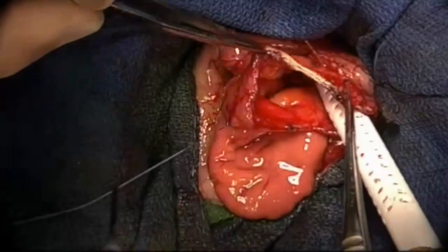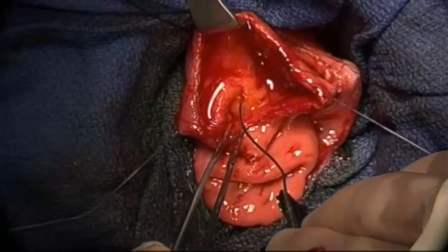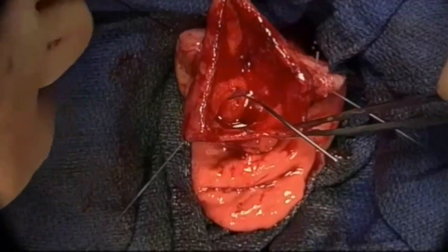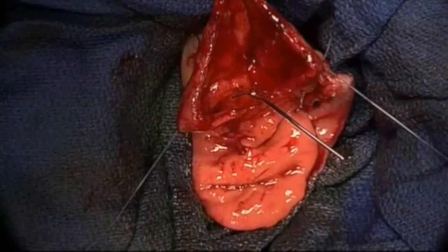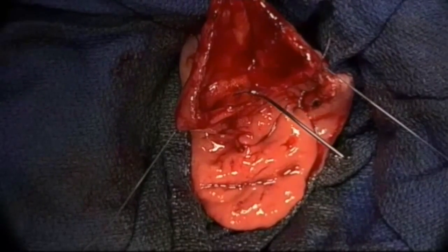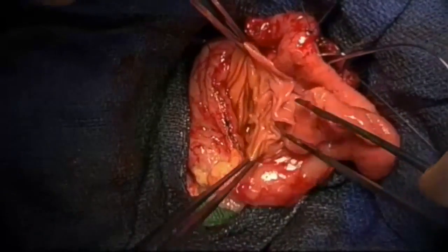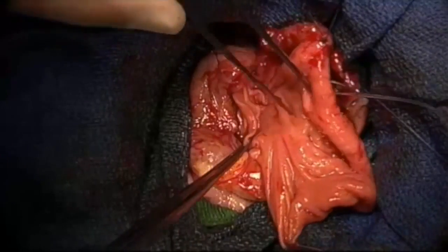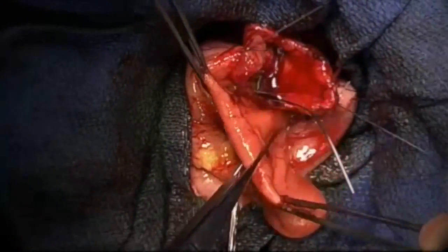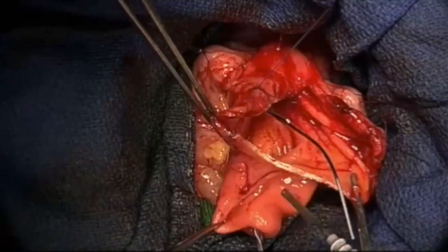Further dissection of the cyst revealed the major papilla opening into the cyst. The major papilla could now be cannulated and the lacrimal probe was introduced into the pancreatic and common bile duct without difficulty. Here we can see the probe introduced through what we thought was the previous EUS puncture orifice.